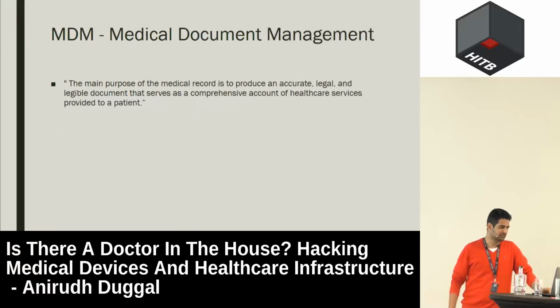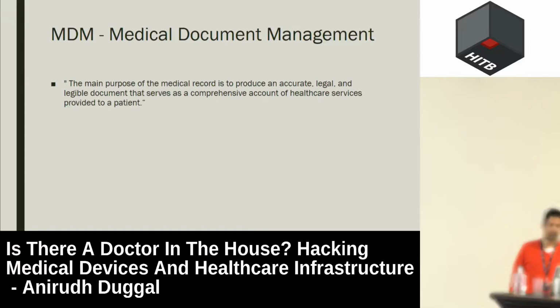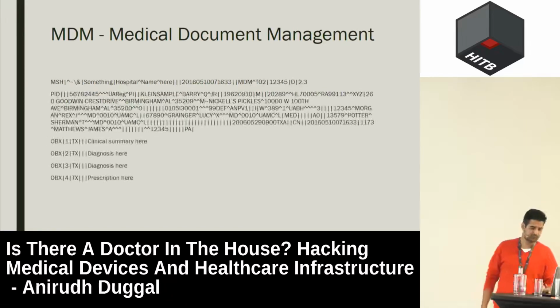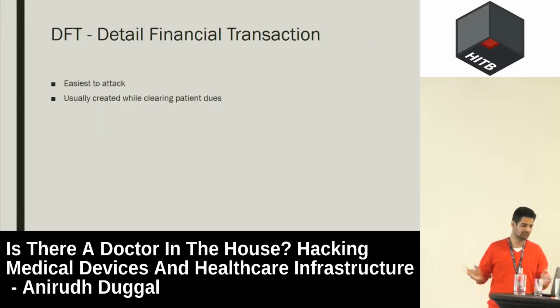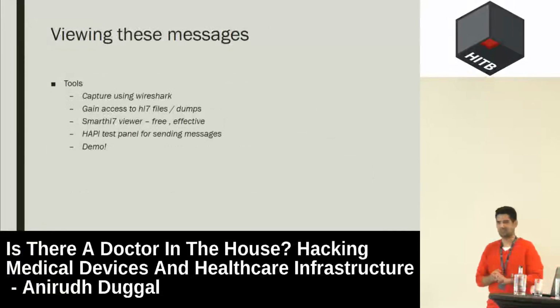And then you have medical document management. This is important because the way it's written, it's a legible document that serves as a comprehensive account of all healthcare services provided to a patient. All right, so the last message is the financial transaction, and this is it. Okay. Now we'll see demos.